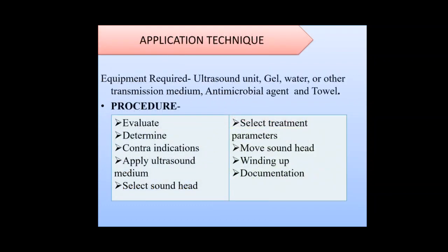Then coming to the application technique. Equipment required for applying ultrasound are ultrasound unit, gel, water or other transmission medium, antimicrobial agent and towel.